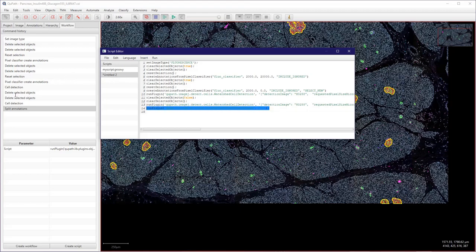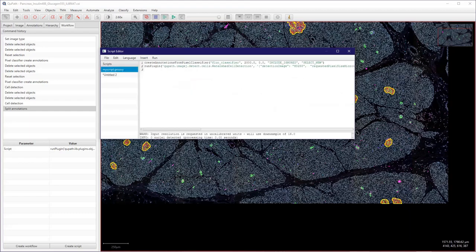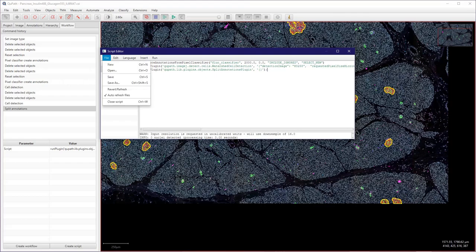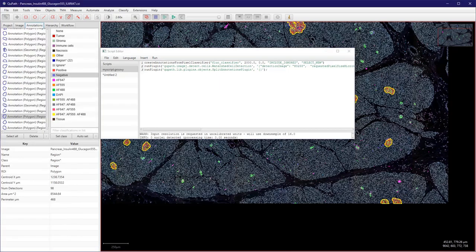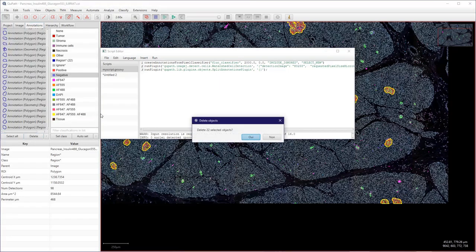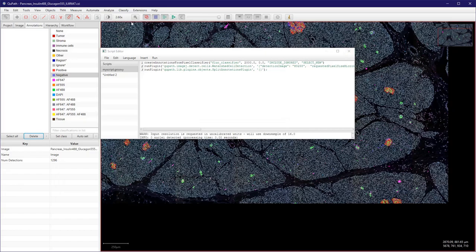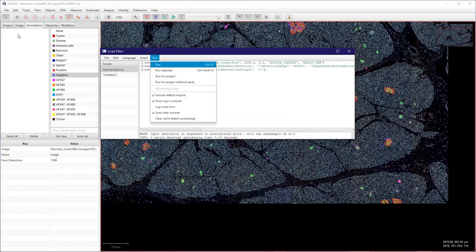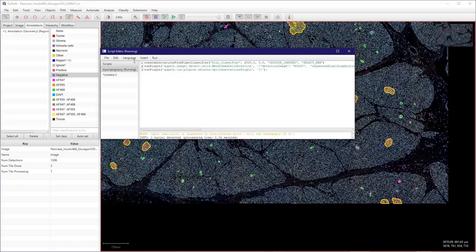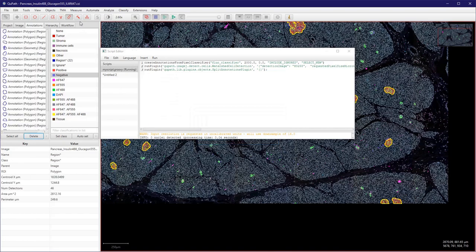So I can copy this and paste this here to my script. Save this. If I go back to annotation, select or delete, and now if I run this again, it creates the region, detects the cells, and splits the annotations in just one command. Pretty efficient.